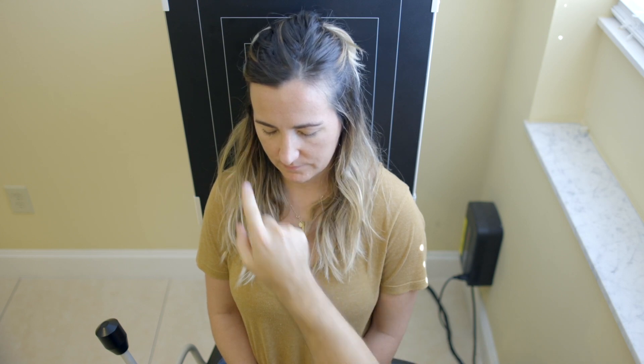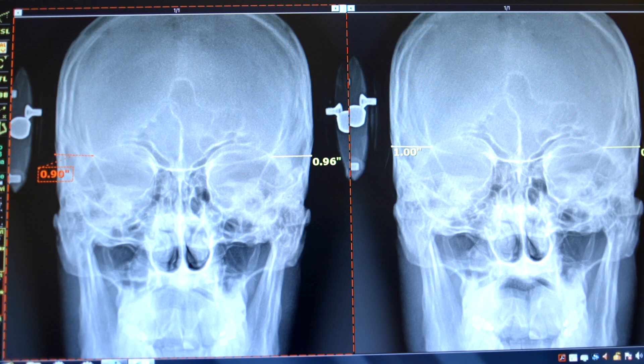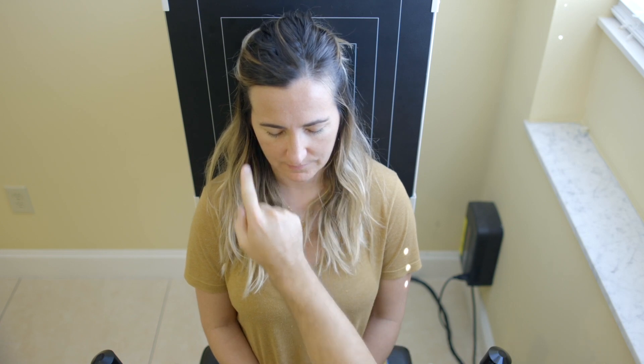You do want to address rotation. You don't want a rotated film — you want to capture the skull perfectly symmetrical in space so you can measure the displacement of structures below. Before taking the x-ray, look at the ocular orbits and the side of the skull. Take rotation out using your chair and get the ocular orbits as symmetrical as possible. If the picture shows you're way rotated, troubleshoot by looking at the patient again, bringing the chair over, and slightly adjusting the head. Use your x-ray findings to properly line them up.